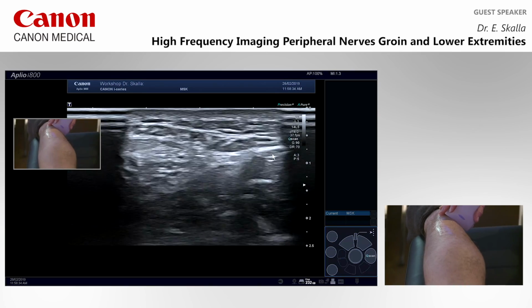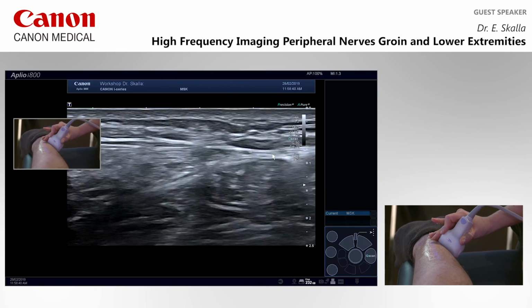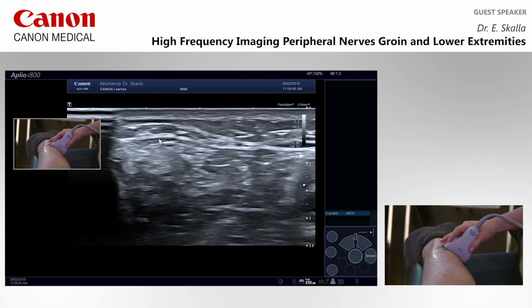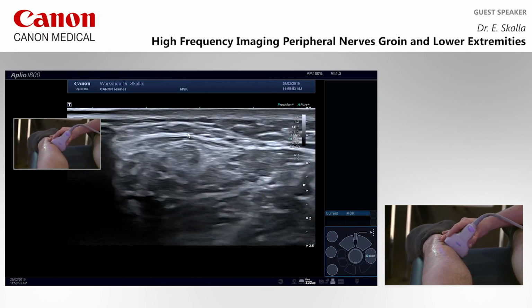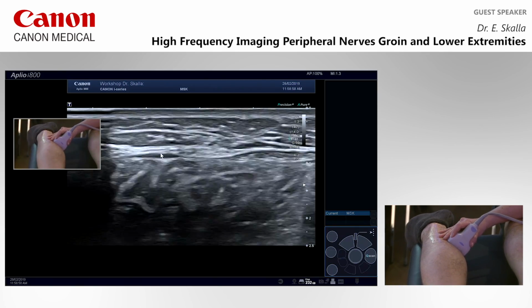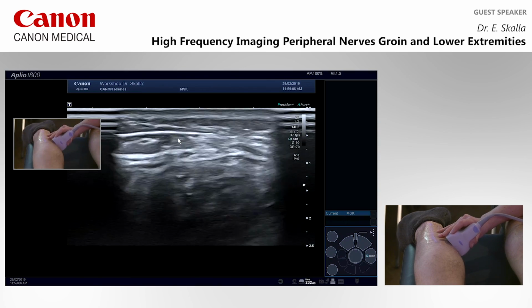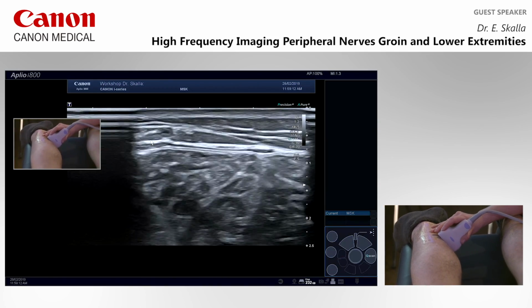In the distal third, here we see an interesting vein. Is this the vein? This one. This must be the vein. Here it's open, as you can see it. So I just have slight contact. Now, it was too much pressure. And we see the vein.